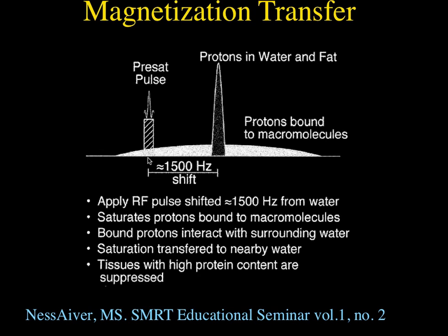If you put a sat pulse in the bound water and then redo your experiment again, if you get a drop in signal intensity within the free water, that means that the saturated nuclei from the bound portion have moved into the free water portion and are saturated and won't give a signal. If you do a sat pulse in the bound water over here and you get no change in the signal intensity you get from doing an MR experiment in the free water, then there will be no interchange of water between the two.